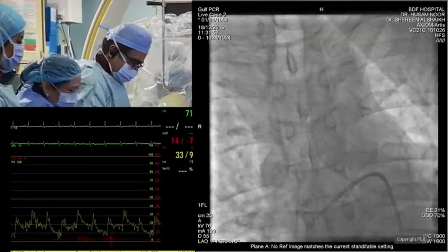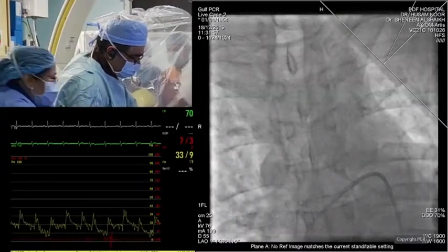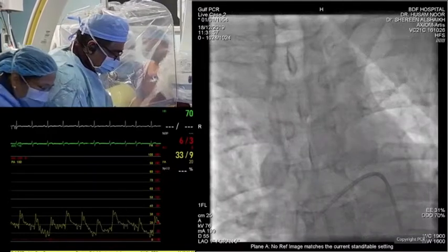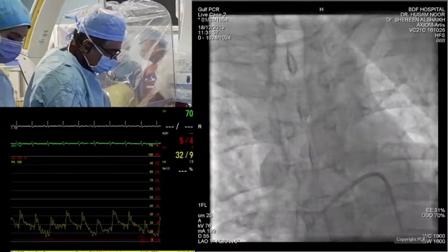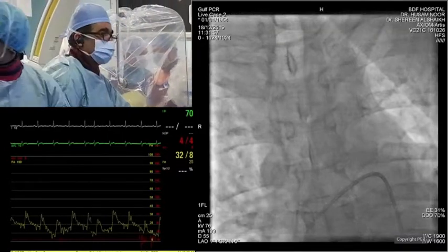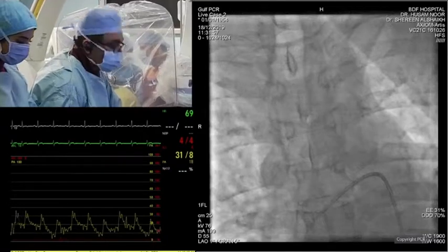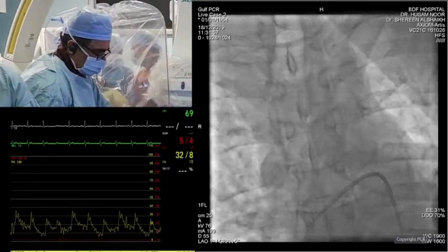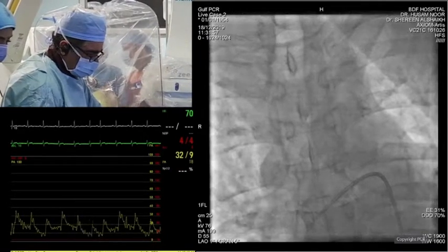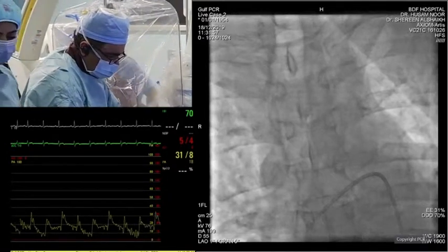Now, I think this is a great demonstration that imaging has helped us avoid rotablation, because this patient otherwise, if we had gone directly with rotablation, it could have been detrimental, especially since it's a LAD with everything else diseased, and here the akinetic circumflex is diseased. So doing that, they actually proved the point, where the balloon opened quite nicely.